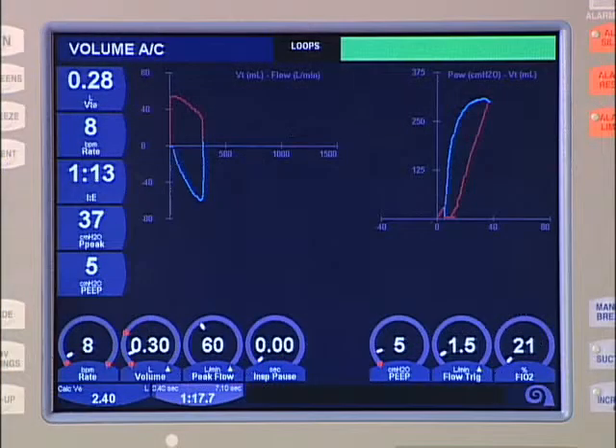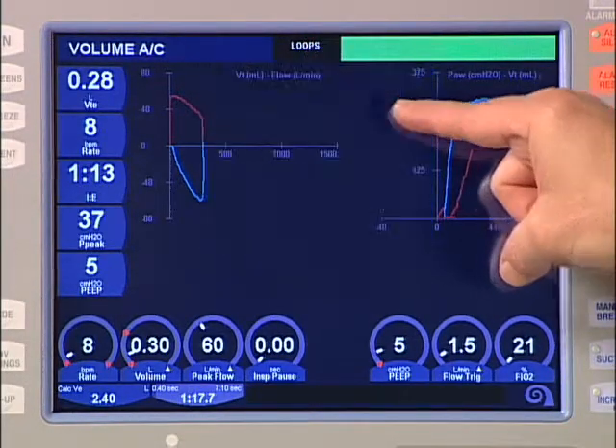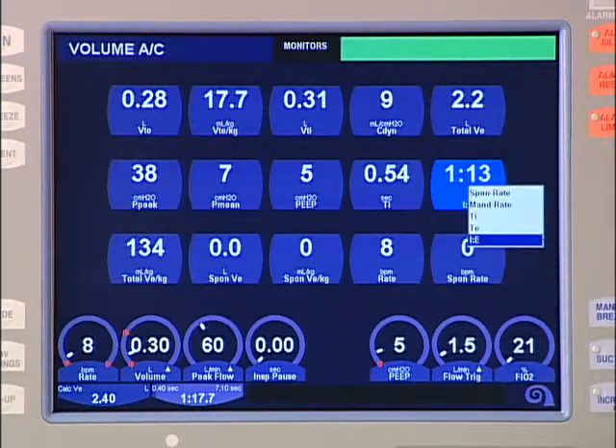An extended list of monitor parameters is available on the monitor screen, accessed via the screens membrane key or by touching the currently displayed screen listing. The monitor screen allows simultaneous display of up to 15 parameters. Each parameter is updated at the start of the next inspiration or every 10 seconds, whichever comes first. Each display can be configured from the same menu of parameters, and the monitor screen can be set up to correspond to your hospital's ventilator flow sheet.